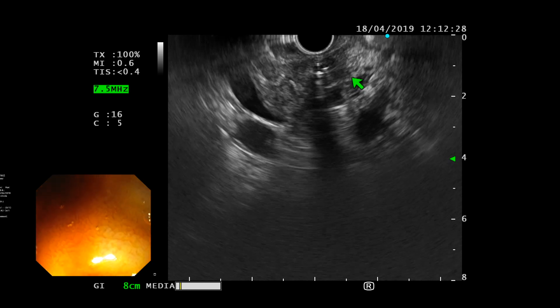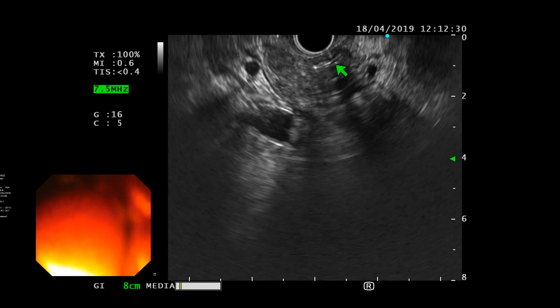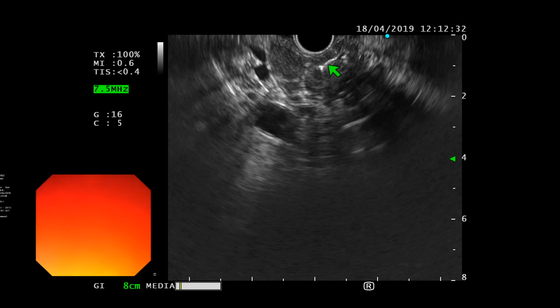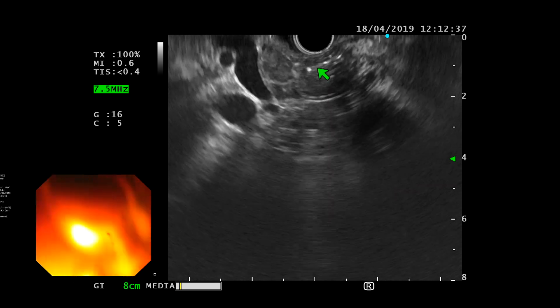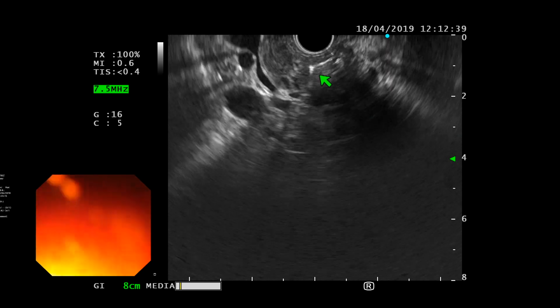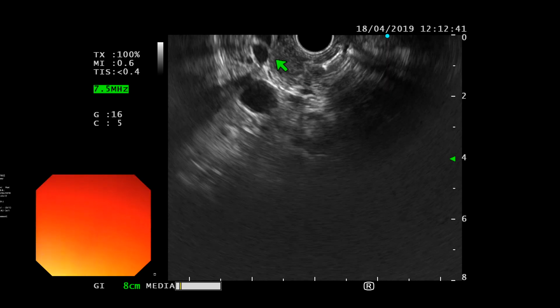Okay. But the stent there, yes. What is this? Yeah, that's the stent, right there. You see the stent? What is this? That's your tumor. See, this is the tumor in the duodenal wall. This is the ampulla area. So that's your tumor.